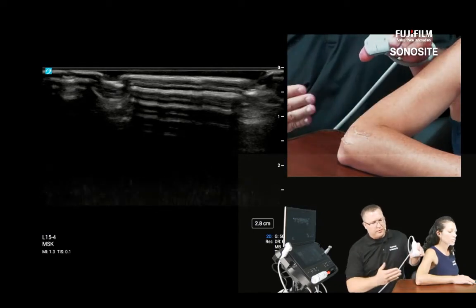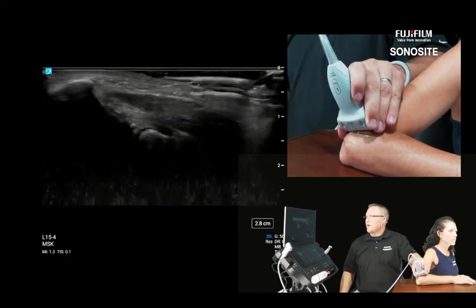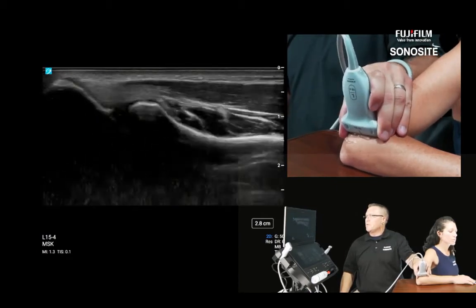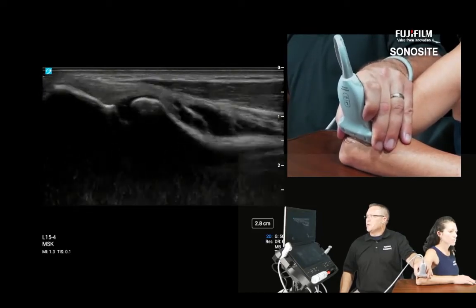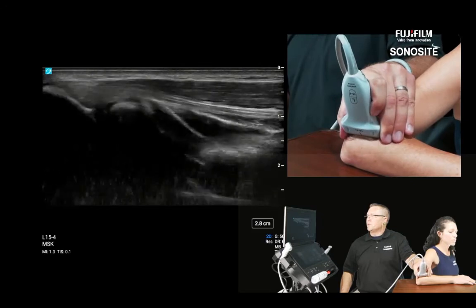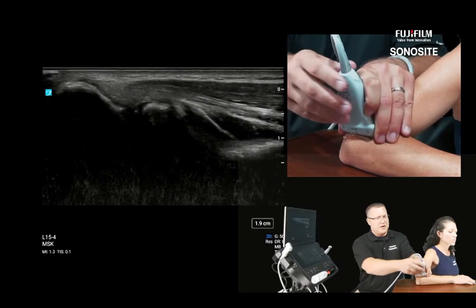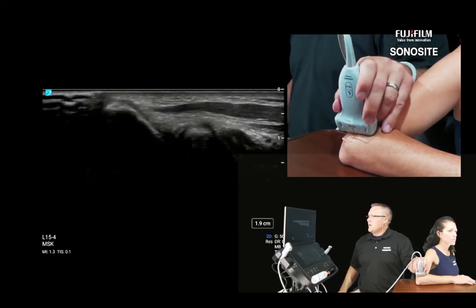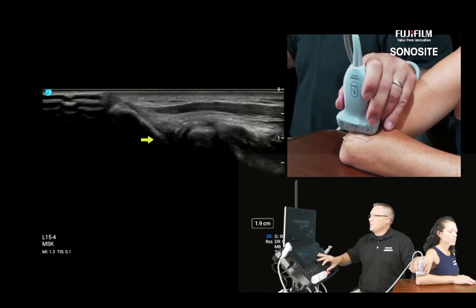So just to understand the trajectory, I would just palpate that lateral epicondyle, left side of the screen, and then lay the rest of the transducer down and just pivot like a windshield wiper, like we talked about earlier, until I was pointed towards the dorsal wrist to elongate that common extensor tendon. I'm going to bring our depth up just a little shallow here. I'm going to change my hand position for the camera, and then I'll start pointing out the lateral epicondyle surface anatomy here.